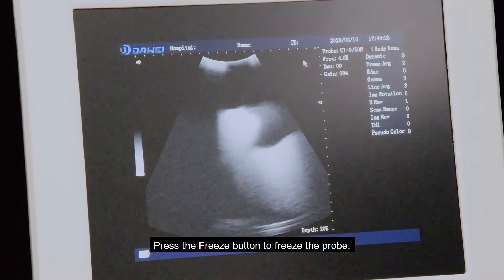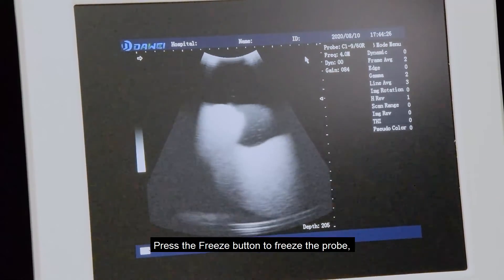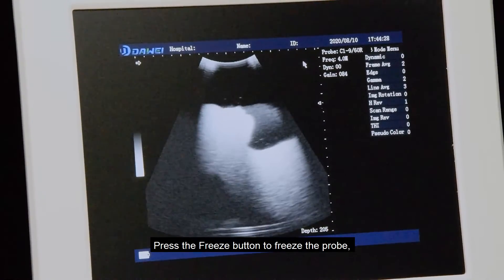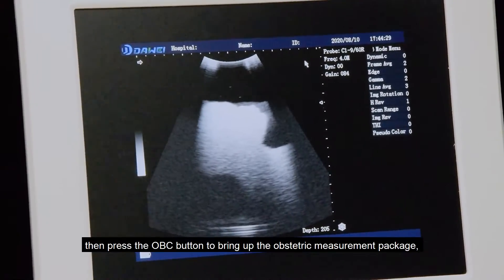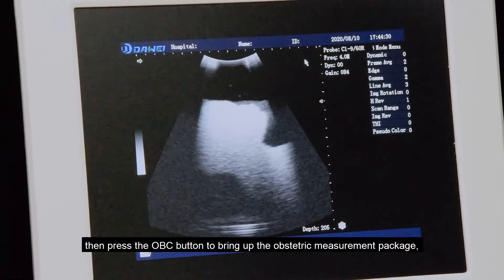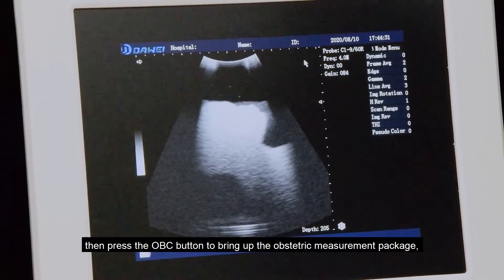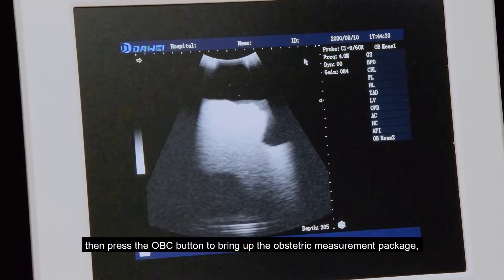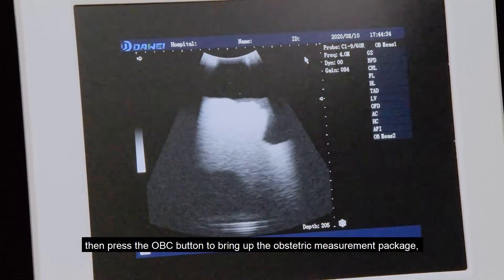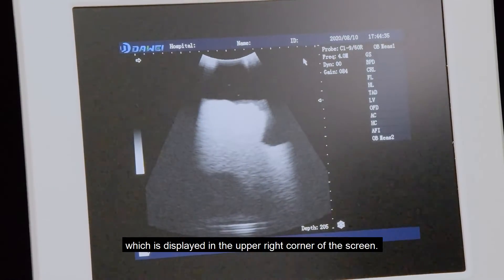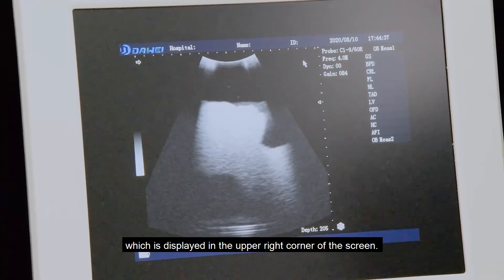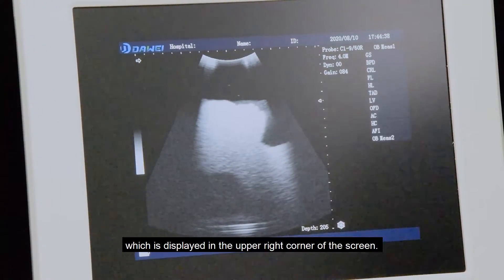Press the freeze button to freeze the image. Then press the OBC button to bring up the obstetric measurement package, which is displayed in the upper-right corner of the screen.